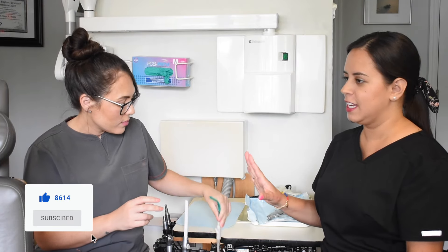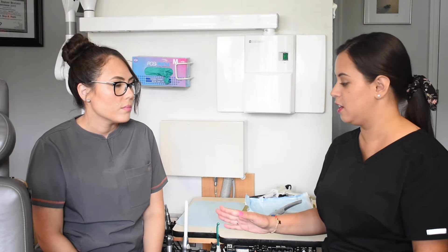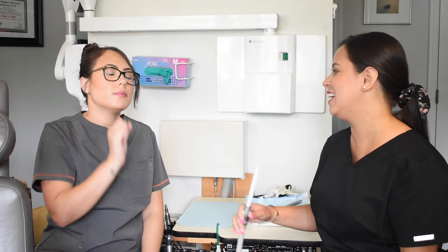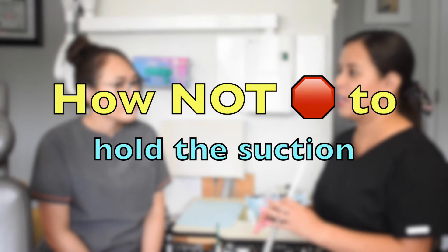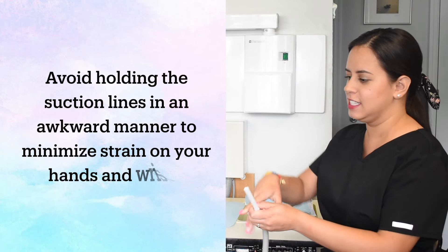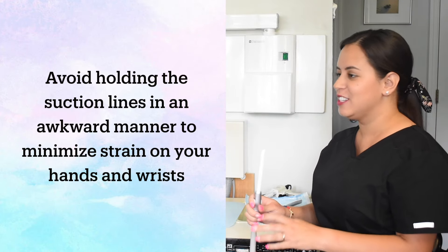It's not going to work out for you. The saliva ejector is just great to have handy for the patient to spit. Now let's talk about the wrong way to hold the suction. Keep in mind that bending your wrist every day for many years can hurt your wrist, so you want to find the most comfortable position for you.